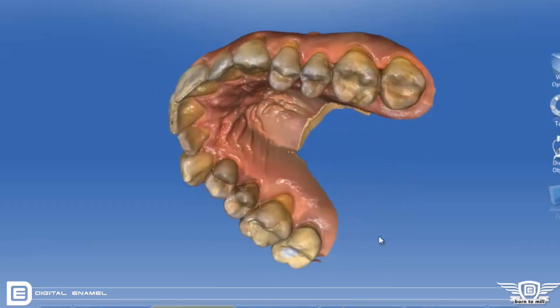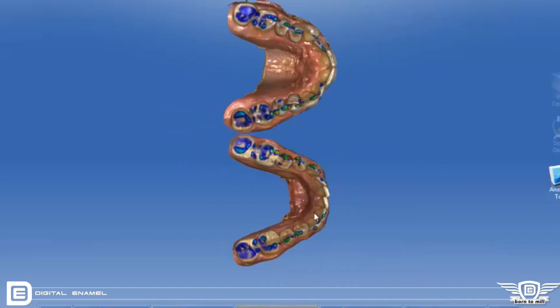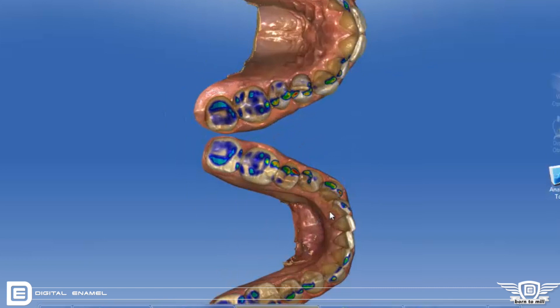What I want you to notice is how great these models look — they're just fantastic. What a great time to be in dentistry. You can evaluate the models, make sure they look complete, and then you check the occlusion.